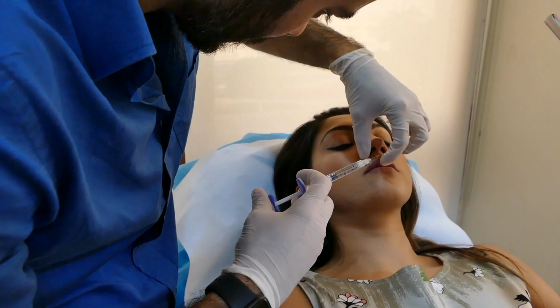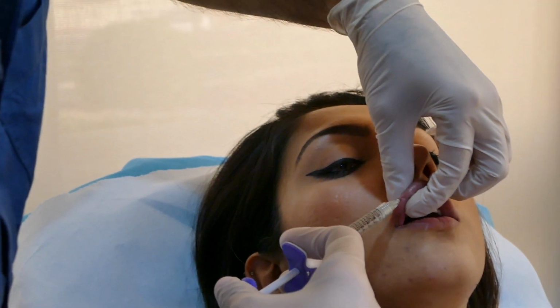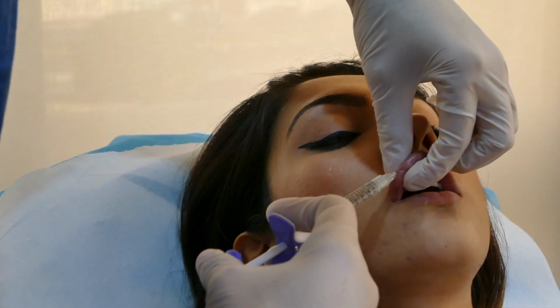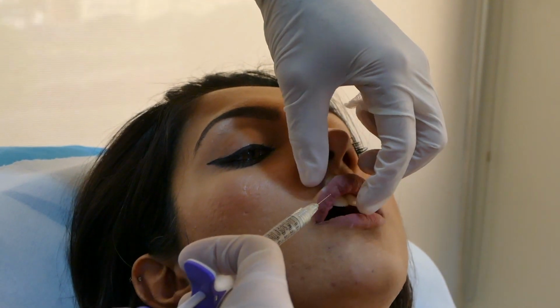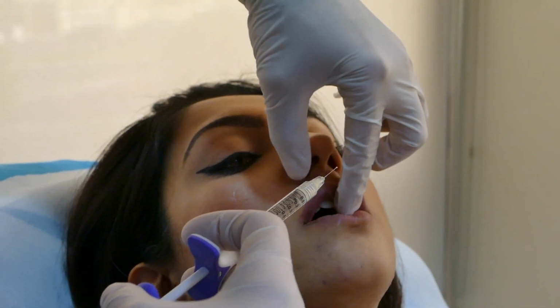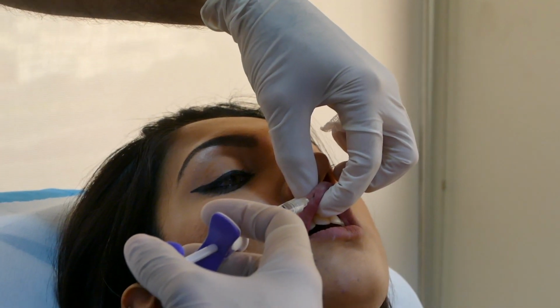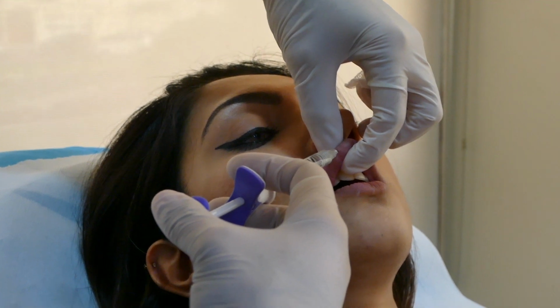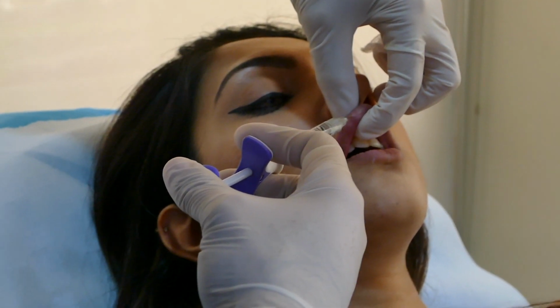That's fine. So on mutual agreement, Dr. Hardik decided to add some more filler in the upper lip, distributing the filler in small quantities and very gently massaging the upper lip. Ensure you do not aggressively massage the lip because it could cause rupture of the veins, hematoma or severe swelling.